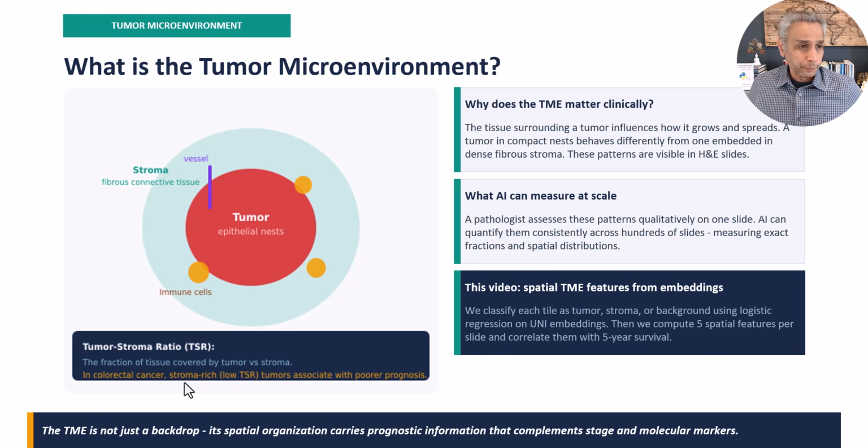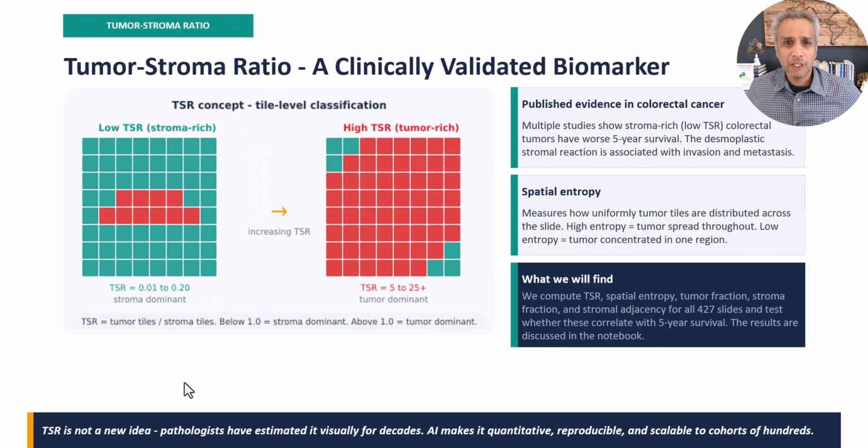Now, I just mentioned TSR, so just a bit more about it. It's conceptually very simple. You classify every tissue tile in a slide as tumor or stroma.